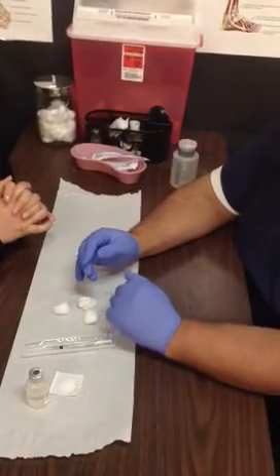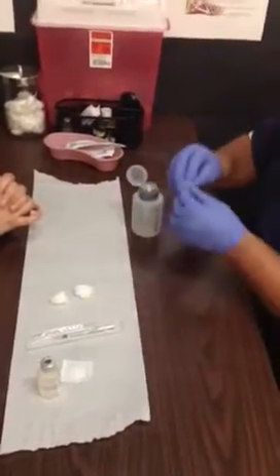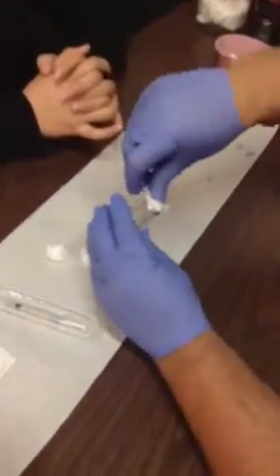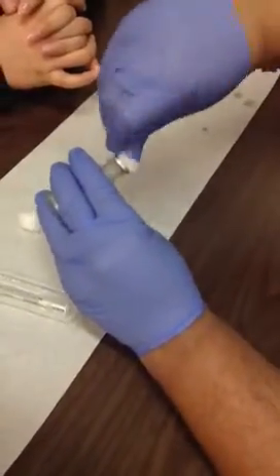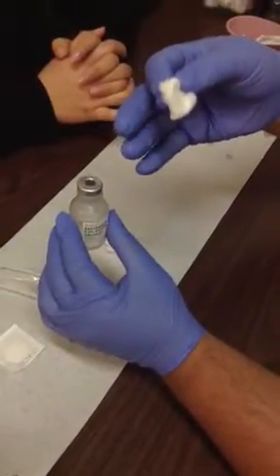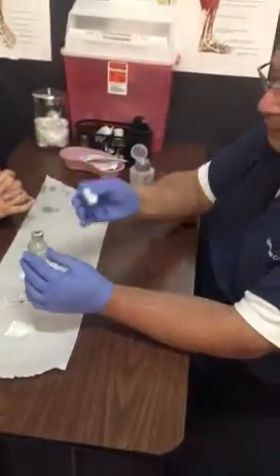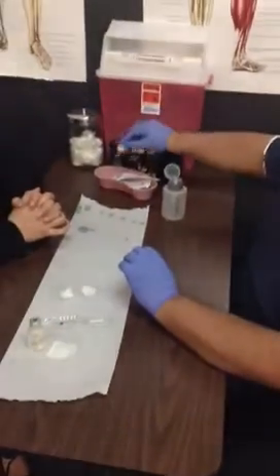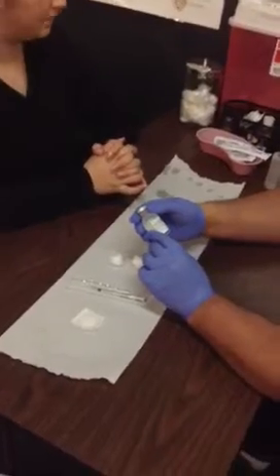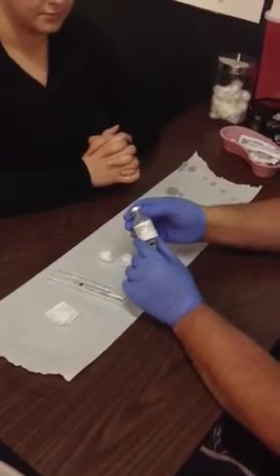Now we're going to begin drawing up our medication. First, prep the top of your vial by placing some alcohol on a cotton ball and pushing and twisting it back and forth firmly. While the vial was sitting in the cabinet, debris, dust particles, even droplets from talking can land on it, and we don't want that contaminated when we put the needle in to withdraw medication. Set the cotton ball down, put it in the trash, and close your alcohol bottle. Before we draw it up, we're going to do our second label check — make sure we have the right medication, it's not expired, and read any manufacturer instructions.